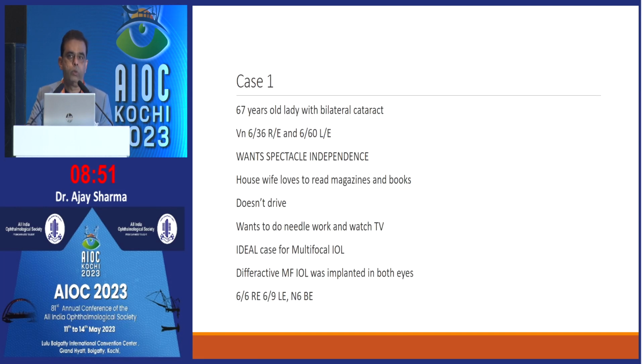Now let's go to the other multifocal lenses. So this is a case of a 67-year-old lady with bilateral cataract, and the patient wants spectacle independence. Now why this is being written is, this is very important. The patient has to demand something.